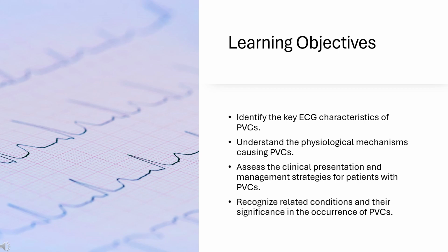By the end of this presentation, you will be able to identify the key ECG characteristics of PVCs, understand the physiological mechanism causing PVCs, assess the clinical presentation and management strategies for patients with PVCs, and recognize related conditions and their significance in the occurrence of PVCs.